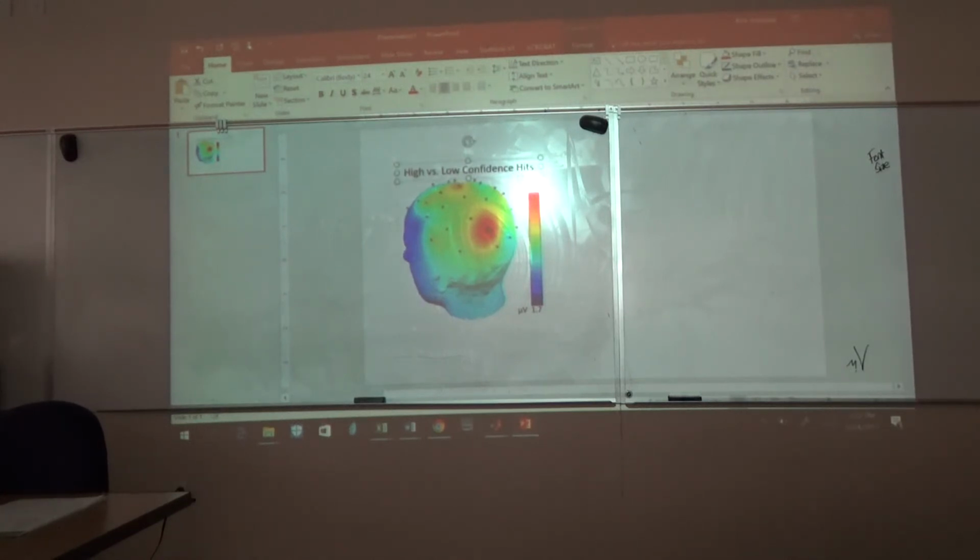Okay. Copy that, and I'll paste it below too, because now it just makes it easier. All I have to do is come in here and change the actual words and say 600 to 900 milliseconds. Now I can select it all, right click, group. Oh, that's pretty nifty looking, isn't it?